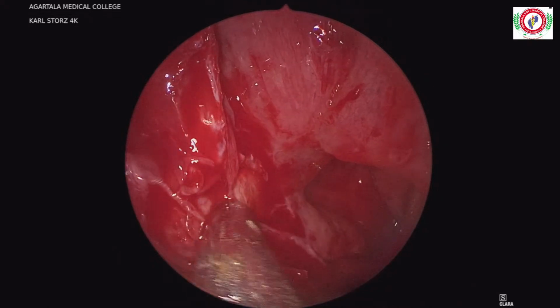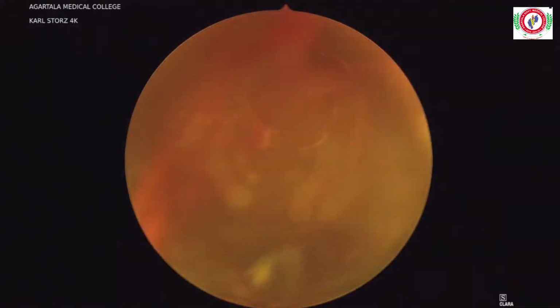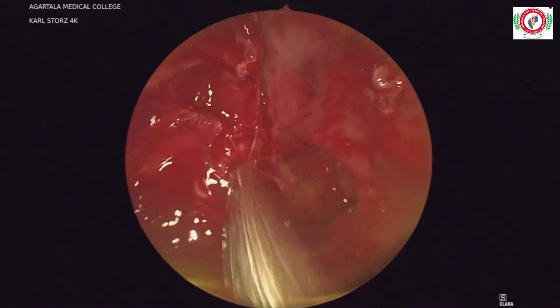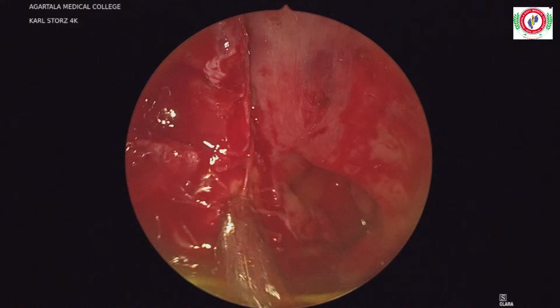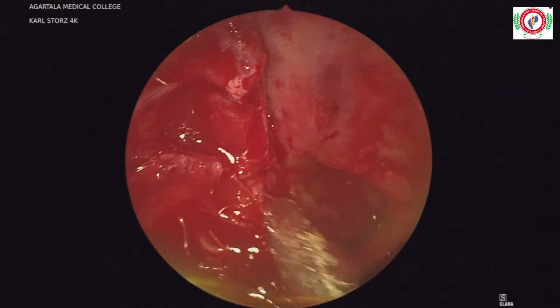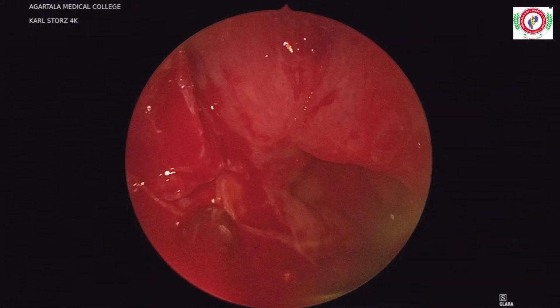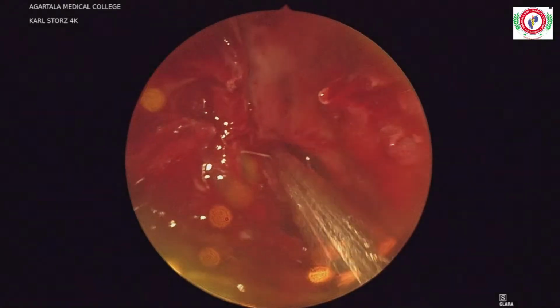Okay, so see this area that I was telling. This whole area is raw. I told you that this tumor went into the pterygopalatine fossa on the right side. See, there is no wall, posterior maxillary wall here. Can you see?